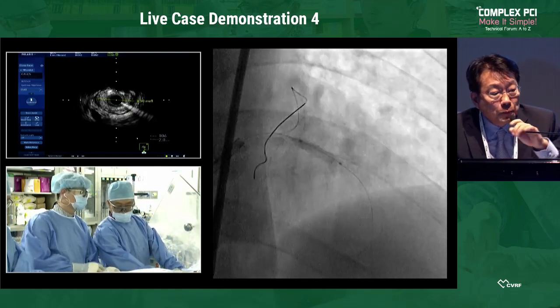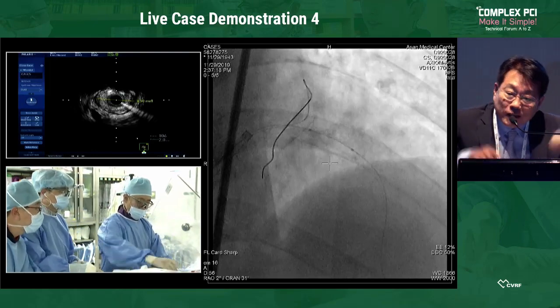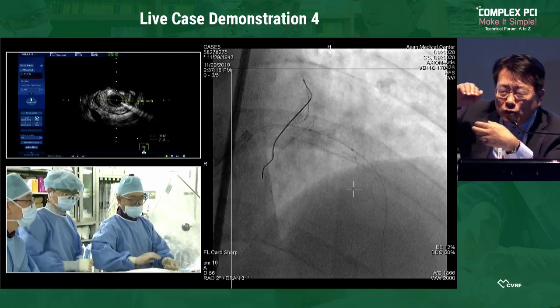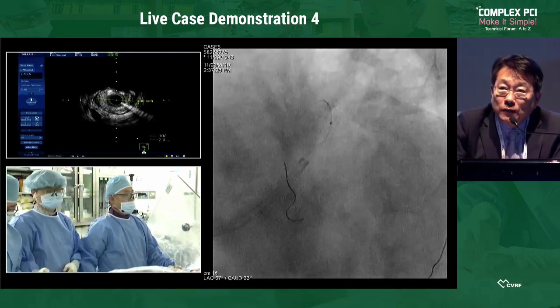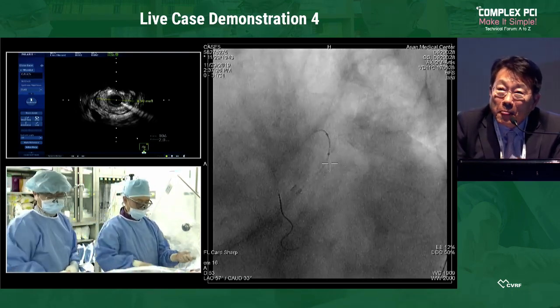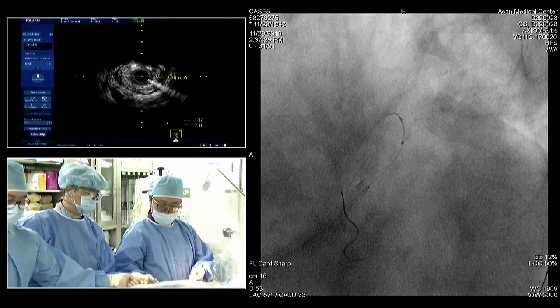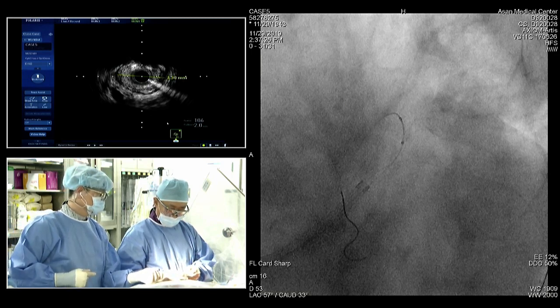So recently, we gathered some data, upfront two stent, upfront three stent, just like these cases, big vessel more than 2.5, where we want to do the stent. However, the clinical outcome is quite good. Yeah, I believe that. But in this case, for sure, I will not try to use only one stent. It's completely crazy to use only one stent in this particular case.